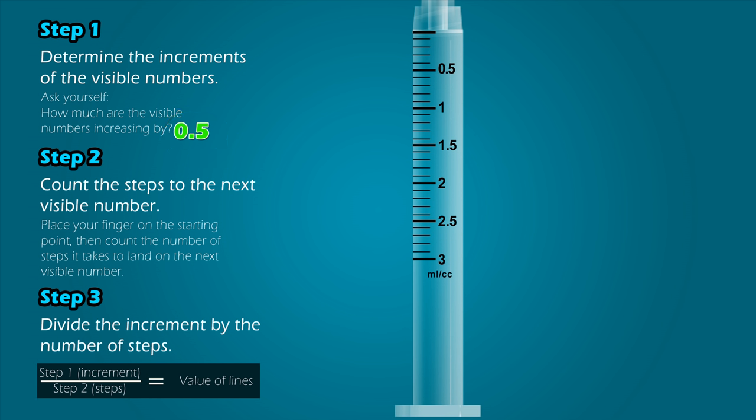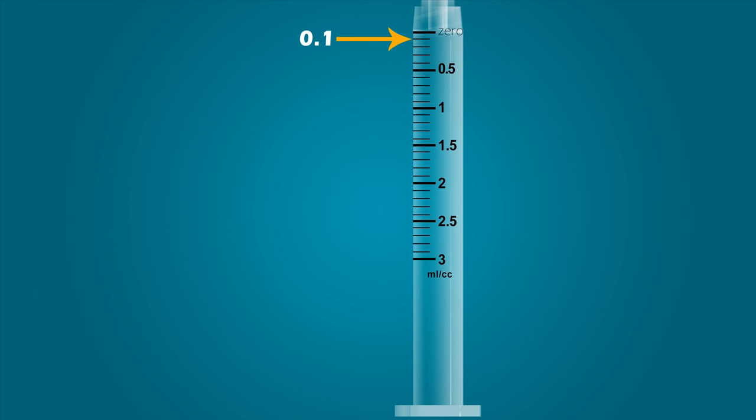Step 2: Count the steps to the next visible number. Our starting point is 0.5, and it takes 5 steps after the starting point to land on the next visible number. Step 3: Divide the increment by the number of steps. When the increment of 0.5 is divided by the number of steps, 5, it equals 0.1 mL. Therefore, each line on the syringe represents a value of 0.1 mL. This line is 0.1, this is 0.2, 0.3, and so on.